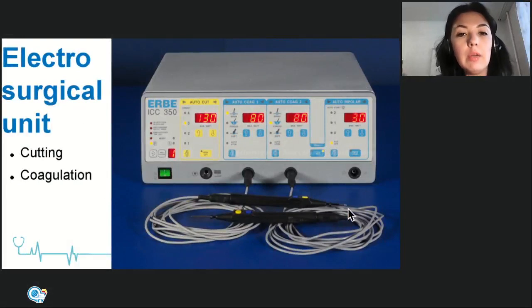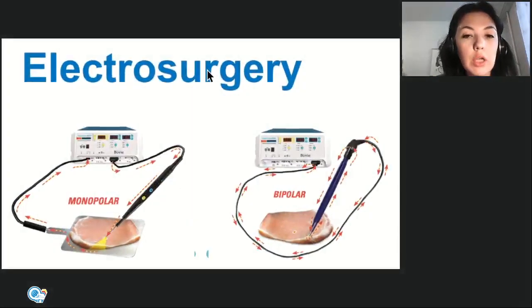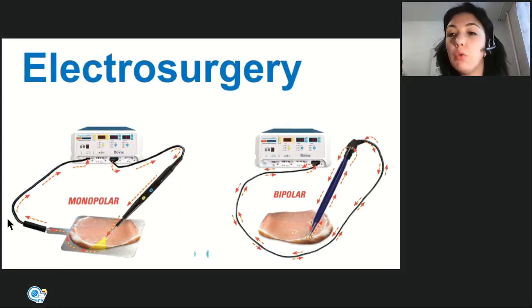The other compulsory system used in surgical interventions, not for diagnostic but for healing purposes, is the electrosurgical unit. By electroenergy, we can work in two regimes. It can be cutting, dissection, and it can be coagulation or cauterization. Dissection is when we dissect the tissues, separate them from each other, and coagulation we use for connection of tissues, for hemostasis, for bleeding arrest. There are two types of electrosurgery used nowadays, but gradually bipolar surgery substitutes monopolar surgery. Why? I will tell you.